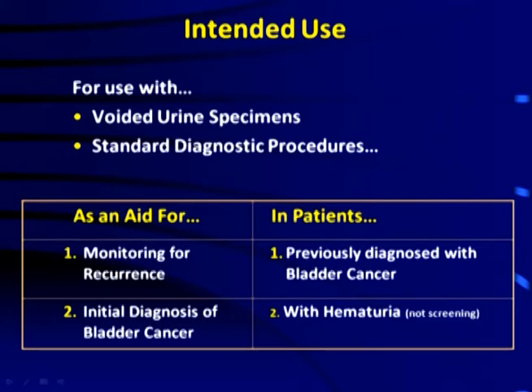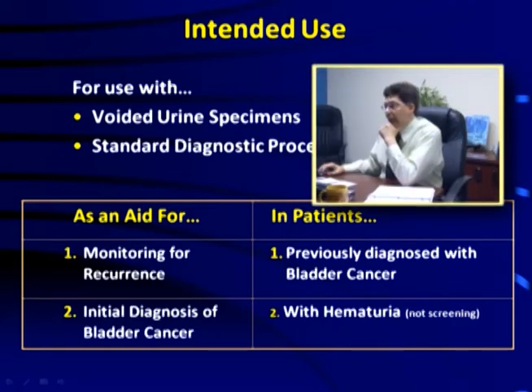It's a genetic diagnostic test, and so hematuria should most likely, or should probably not be microhematuria, and there should be in combination with either atypia or a history of smoking, but it's clearly defined in the literature and in the FDA insert. What we're seeing is, since 2005, a tremendous uptick of the use of this test, and we're really seeing it used as a screening procedure. I mean, it is what it is. It's a very powerful genetic test.